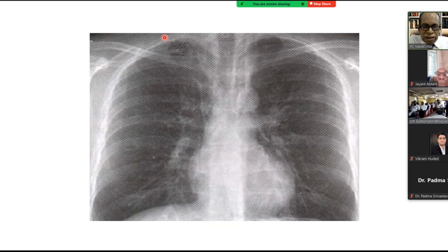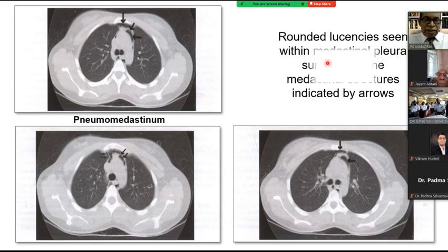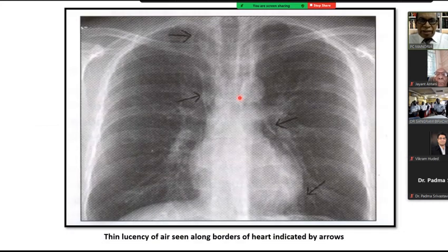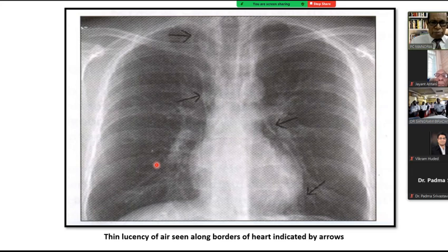X-ray chest was done, and this is the X-ray chest. So what should we do? Obviously this is not coronary artery disease, so we got a CT scan, and you can see here in the mediastinum, and this was the cause of chest pain. So sometimes these conditions also mimic acute myocardial infarction. As you can see, the X-ray did give a hint here in the mediastinum, but it was totally missed because we had not seen such a case in the past. In retrospect, it could have been picked up, but unless you see more cases, it was missed. So thank you very much for your kind attention.